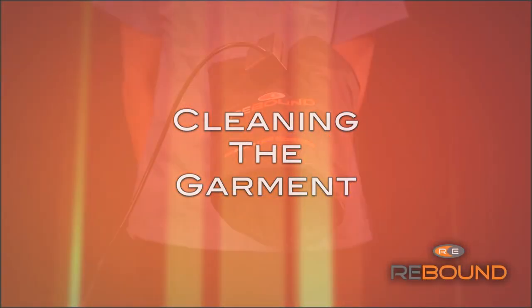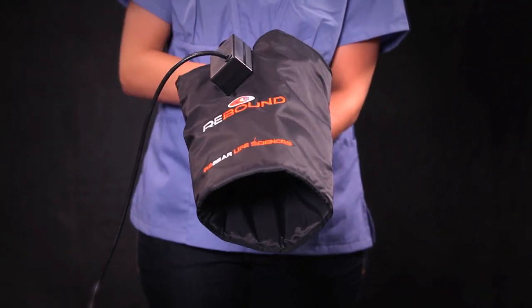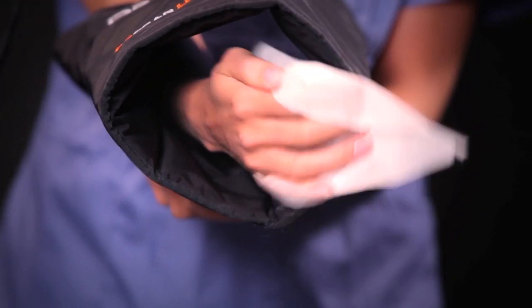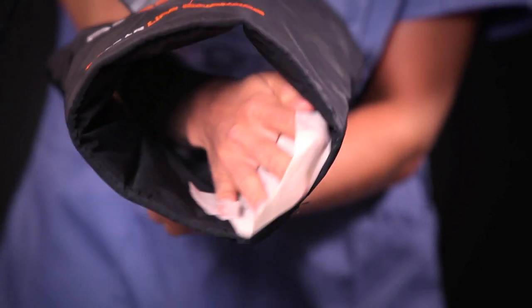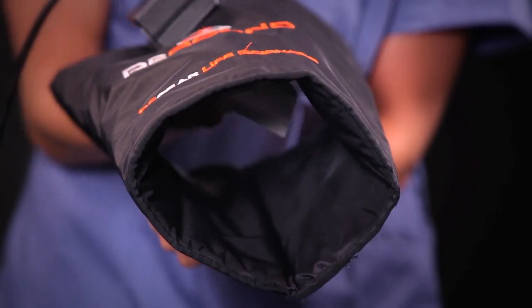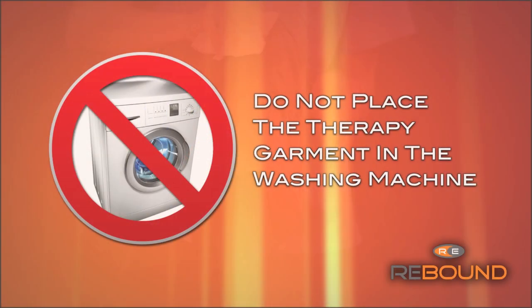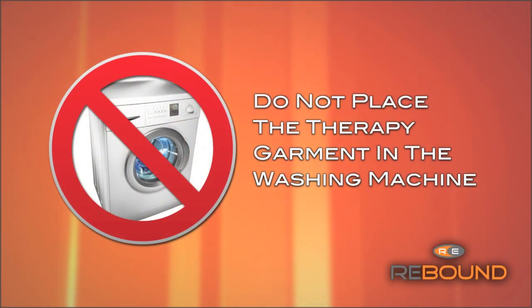Cleaning the garments: it is recommended to clean the therapy garments in between uses. Simply wipe down with an antibacterial wipe or spray. Additionally, the fabric contains an antimicrobial agent that helps to prevent the buildup of fungus or bacteria. Do not place the therapy garment in the washing machine.